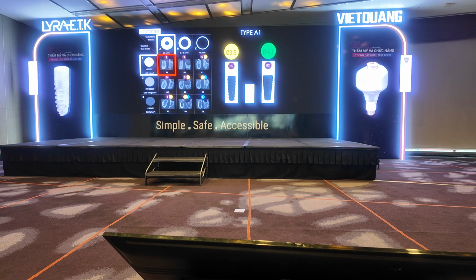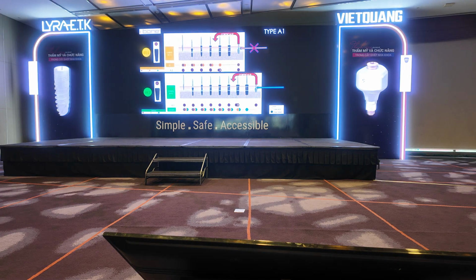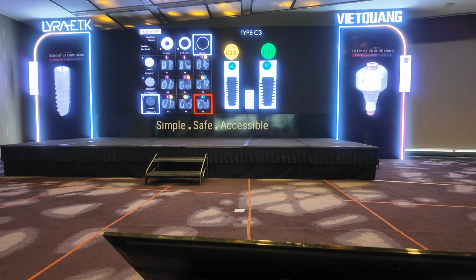So let's take the best one and the worst one. The best one is the A1. We have the kind of implant we need to use. You see that it's an implant without large threads, and you have a protocol to drill for this kind of bone. And then the type C3, which is the worst one, no cortical, no cancellous, the worst case is this one.